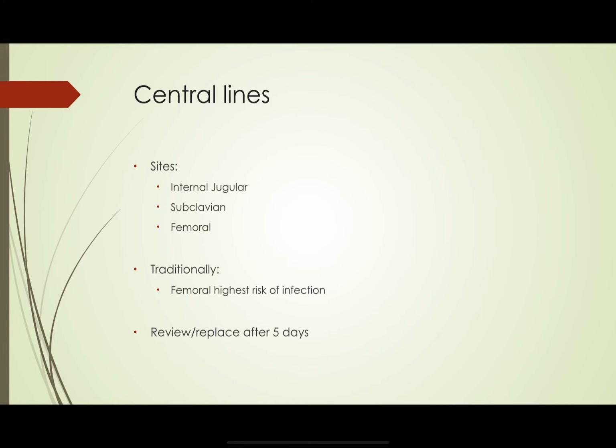In terms of central lines, there are 3 main sites that we put them in, and they are the internal jugular, the subclavian and the femoral.